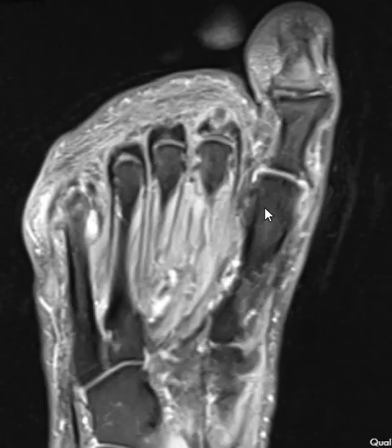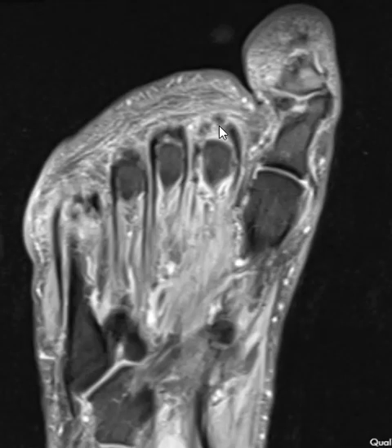Also, their first metatarsal head is shorter than the second, which places abnormal stress here — so that would go along with a plantar plate tear as well. Now we're going to confirm with a sagittal view.